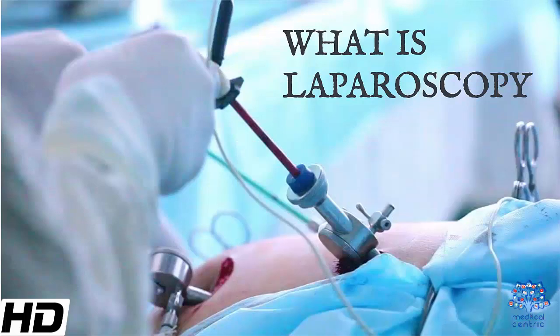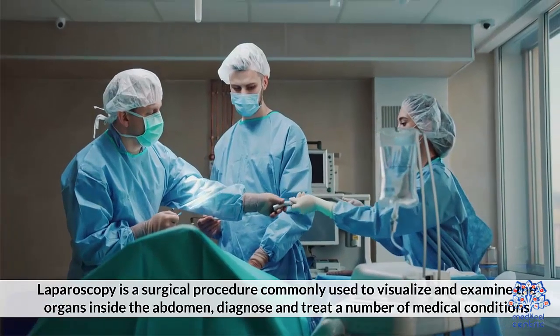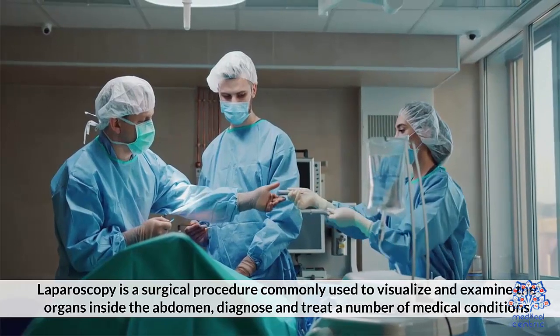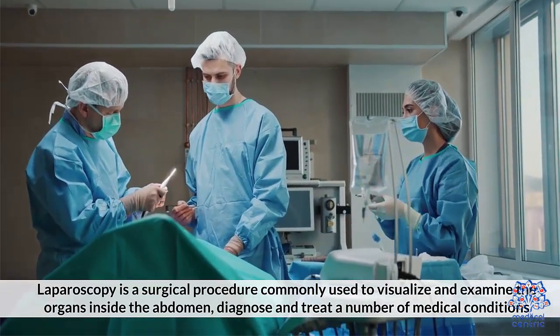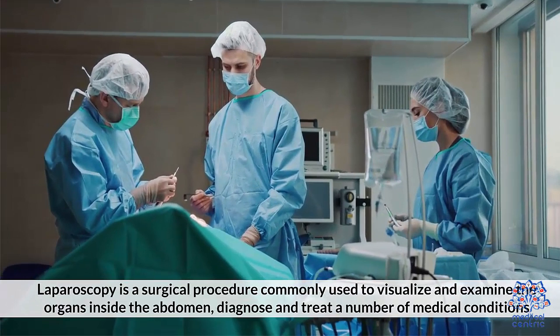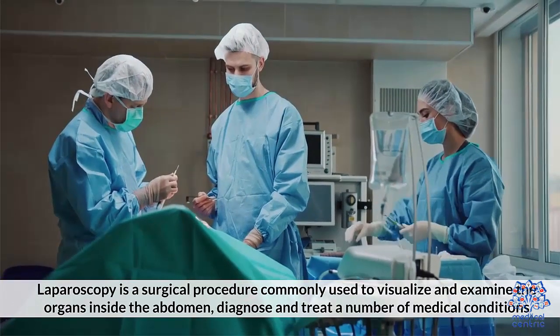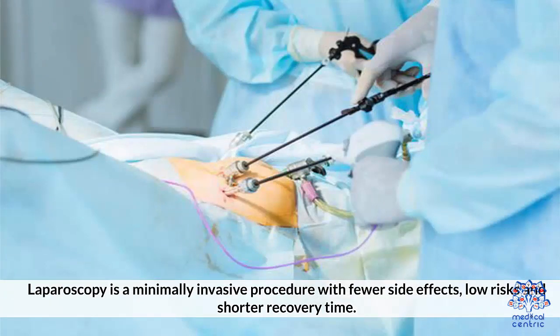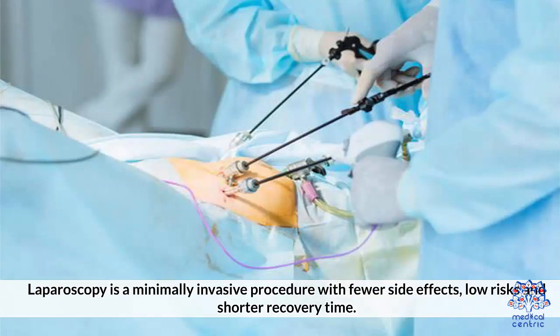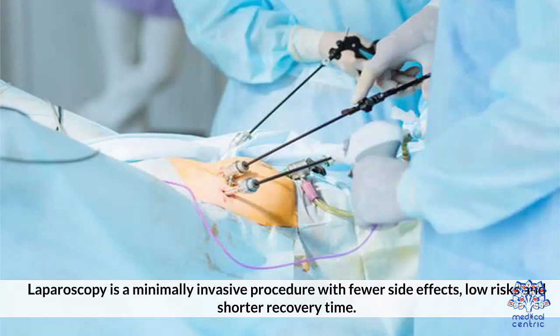Today's topic is: What is Laparoscopy? Laparoscopy is a surgical procedure commonly used to visualize and examine the organs inside the abdomen, diagnose and treat a number of medical conditions. Laparoscopy is a minimally invasive procedure with fewer side effects, low risks, and shorter recovery time.